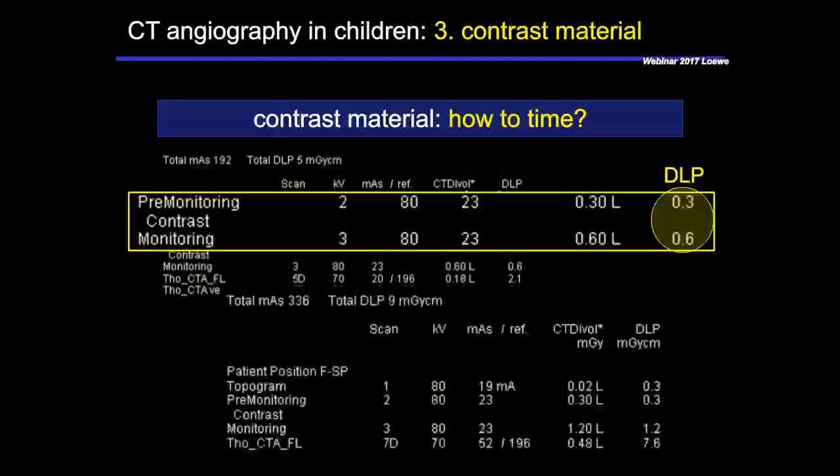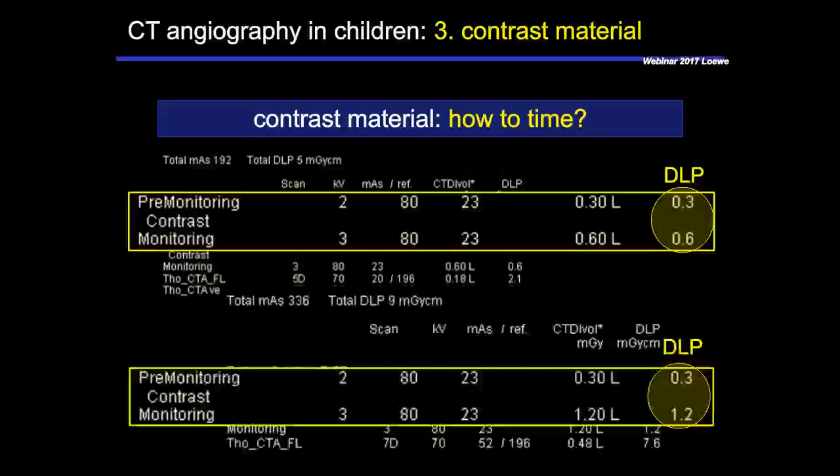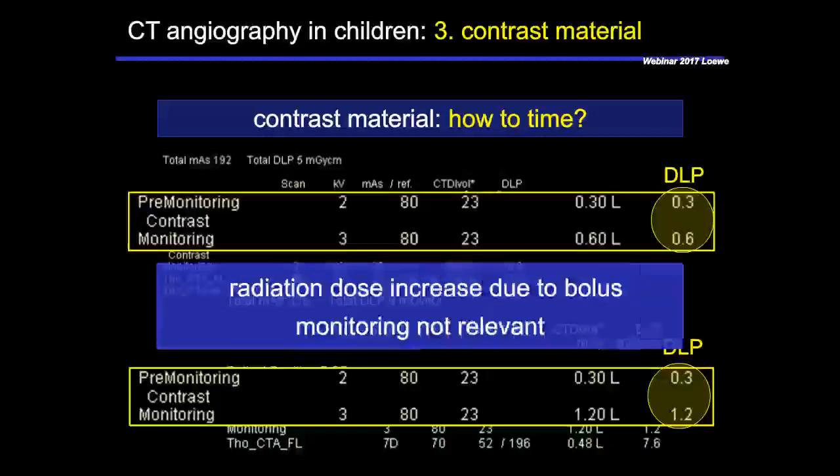And from my point of view, it's really well invested. It's really very slightly increasing the total exposure, but it gives you the total safety that you have a perfect timing and you end up with a perfect scan. So I think the radiation dose increase due to the bolus monitoring is not the relevant issue.